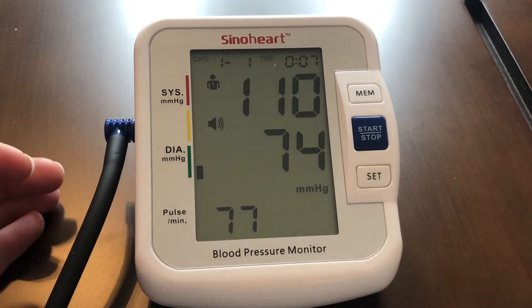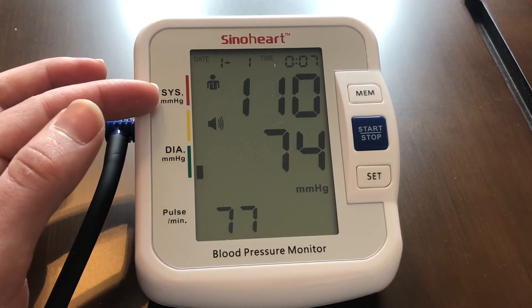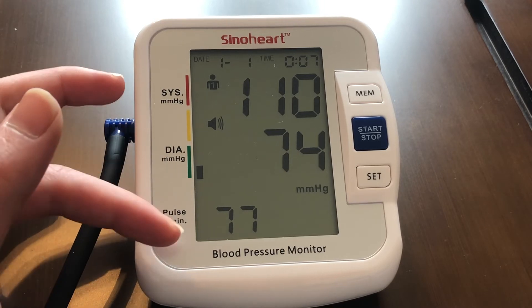As you can see, not only was this easy to hear, but you can also read the systolic blood pressure, diastolic blood pressure, as well as the heartbeat.